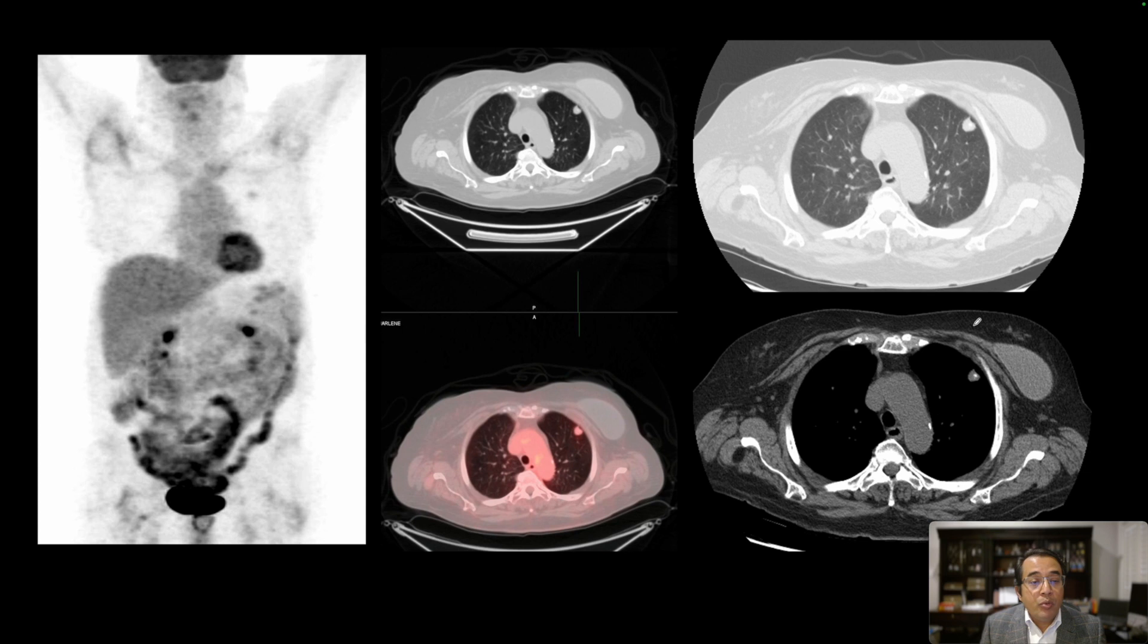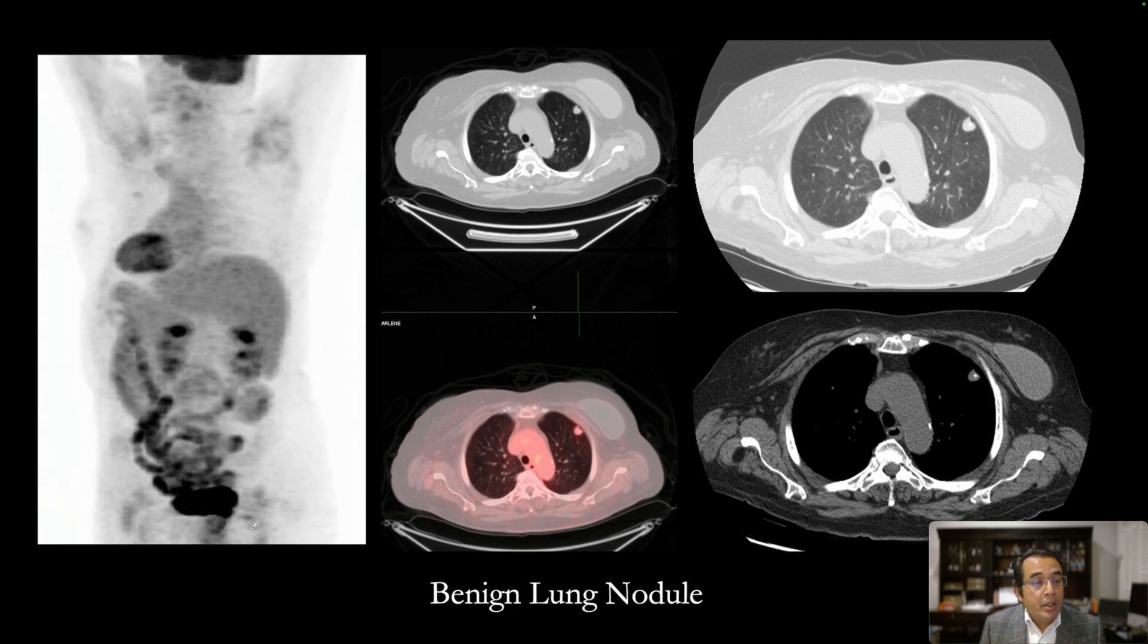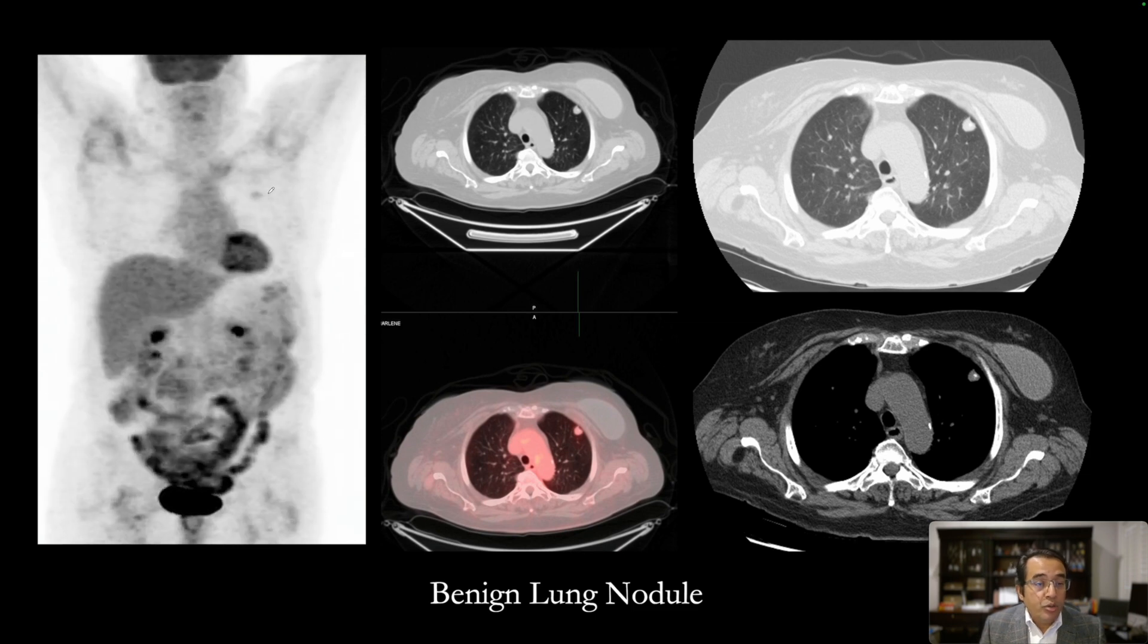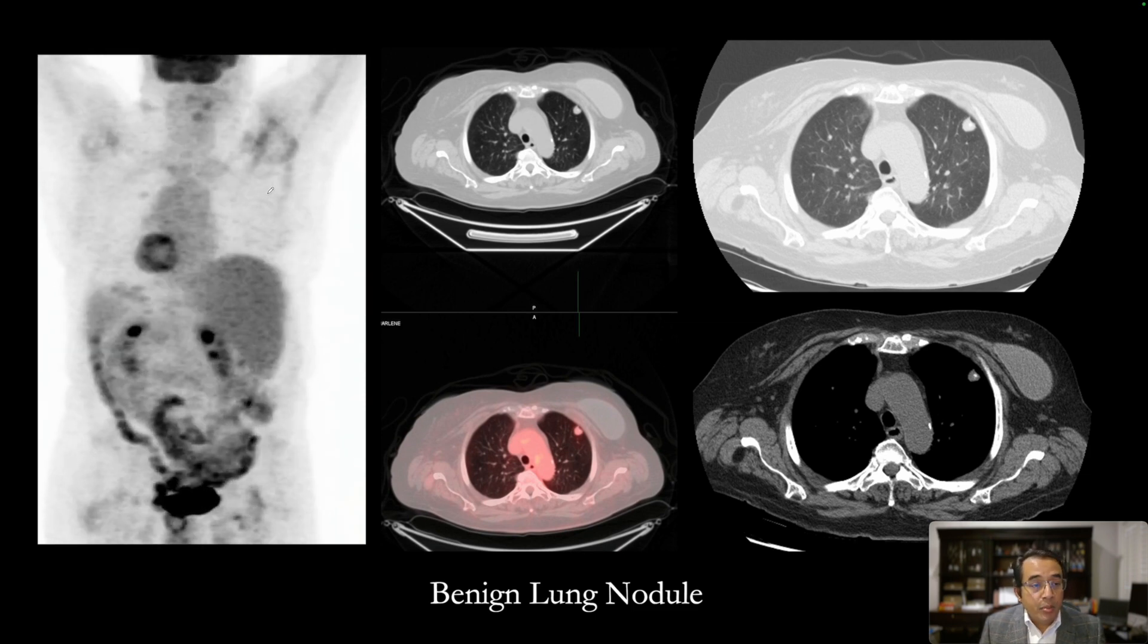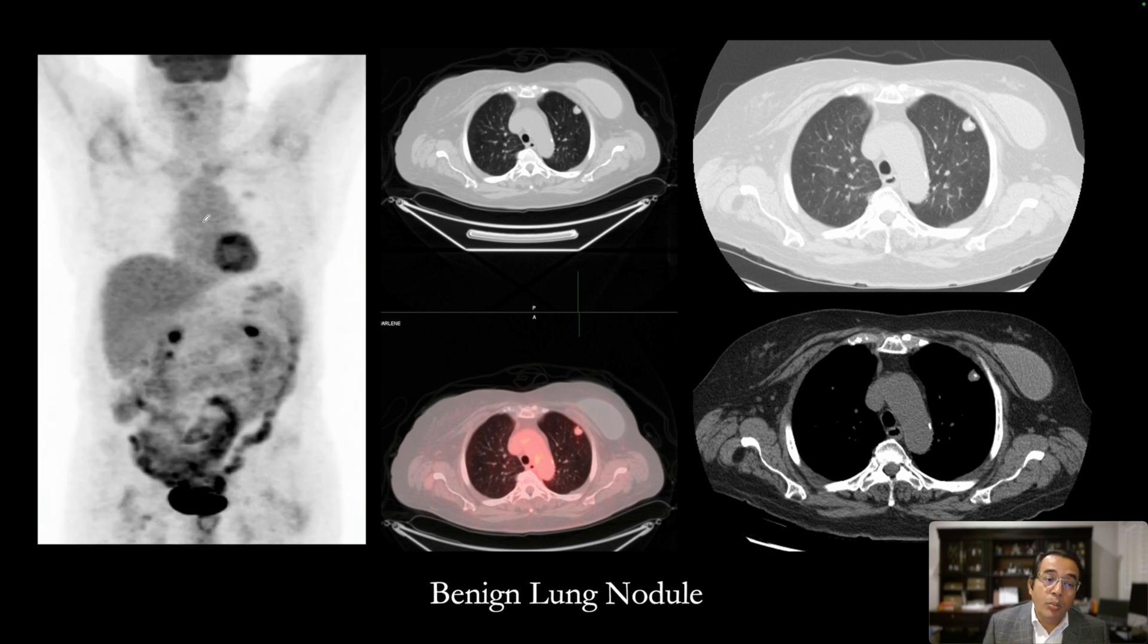Our next patient was being evaluated for a lung nodule. They underwent a FDG PET-CT study, and here is their rotating image. The rotating image shows mild uptake in the left upper lobe lung nodule. The intensity of the uptake is less than the mediastinal blood pool.